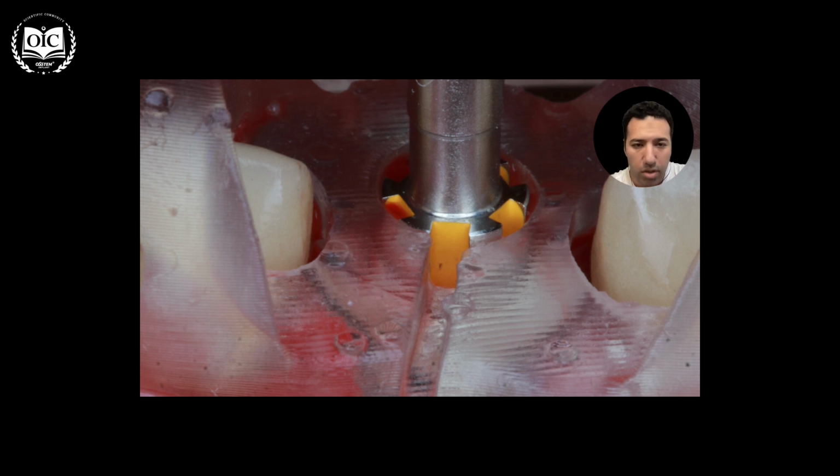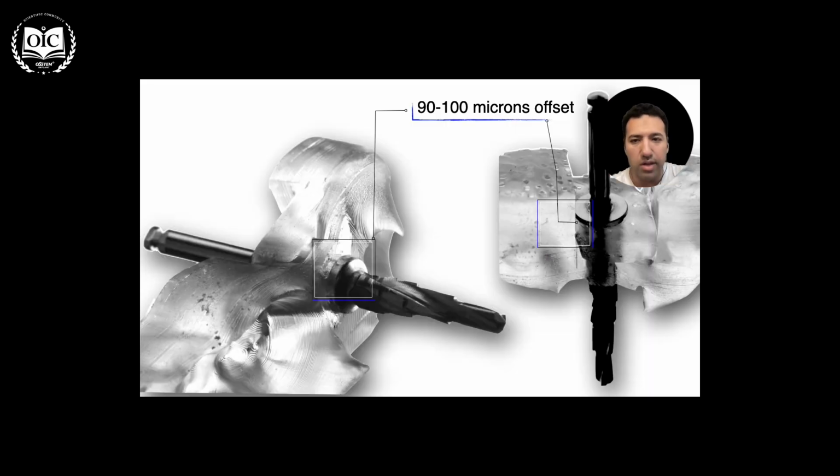See the small gap between the driver and the guide gives you a very small margin of discrepancy in the drilling protocol, and makes you not feel a false torque on the walls of the guide from the inside. Also, the yellow mark, when it matches the mark that you have in the guide, that means the hex orientation is matching the provisional design of the restoration, and it's going to be seated passively without any problems.